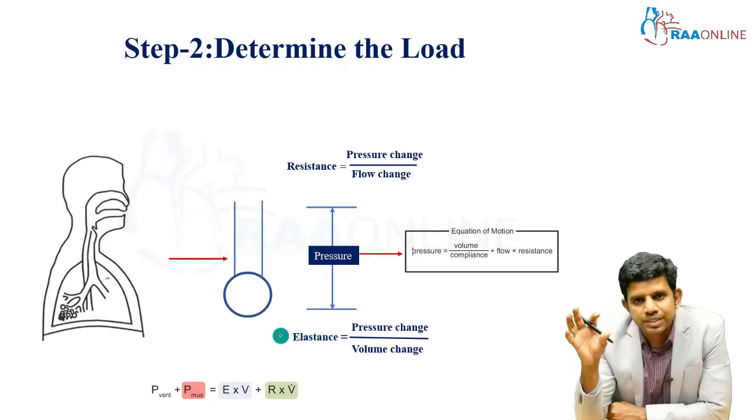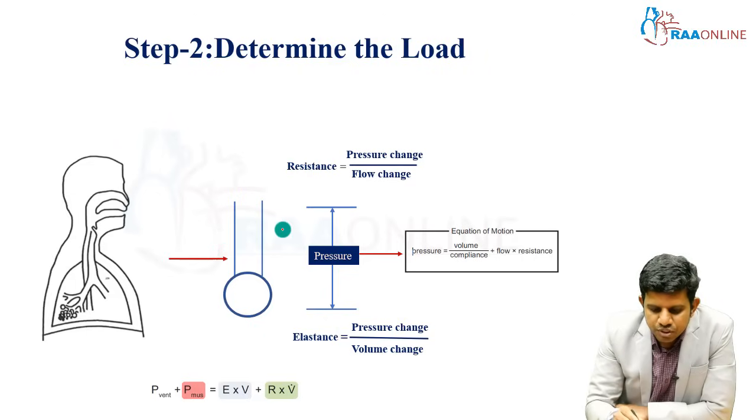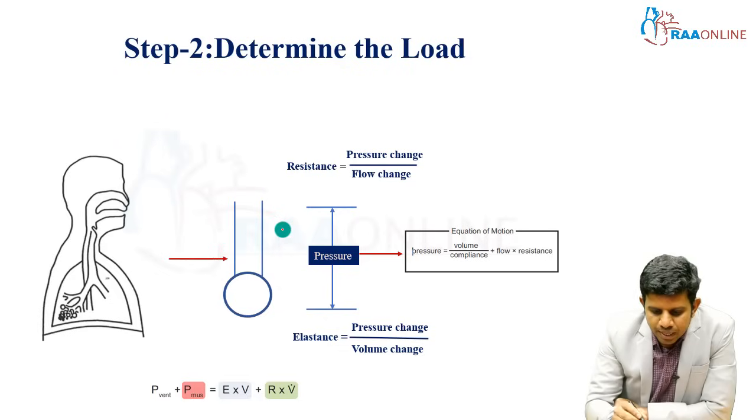Before going on to determine the load, you should all know about the equation of motion. We already discussed it multiple times. The equation of motion is a mathematical equation. Normally the lung is a multi-compartment model, but for this simple explanation we are taking a single compartment model. Here, this is your airway.